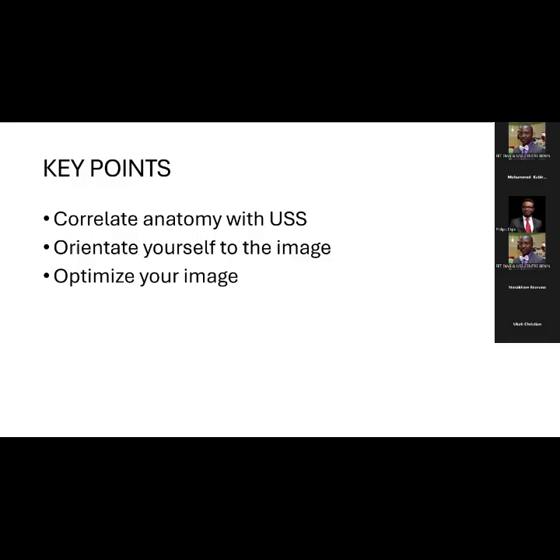There are times you find that the endometrium is looking like a leaf with the widest part almost like the mid segment of the uterus. You will have to take that mid segment of the uterus as your endometrial thickness. But where it looks like it tapers toward the cervix and it is widest toward the fundus, then you take the widest part of the fundus as your endometrial thickness.